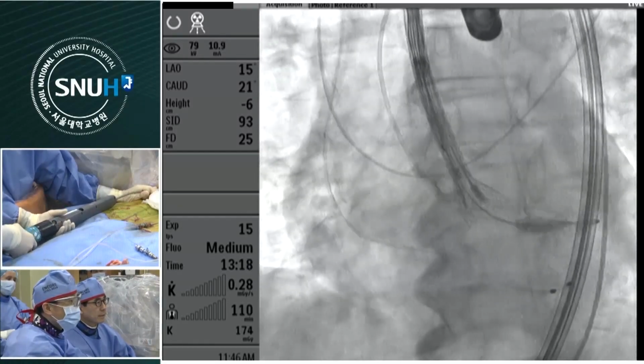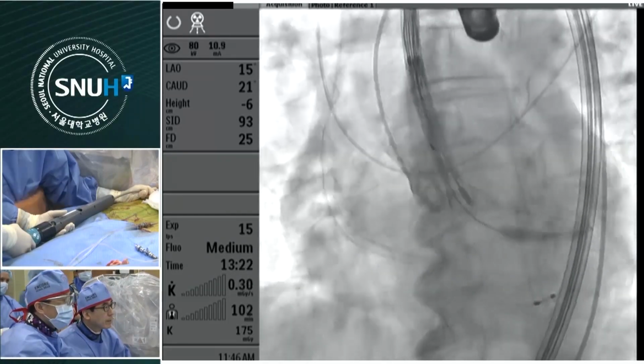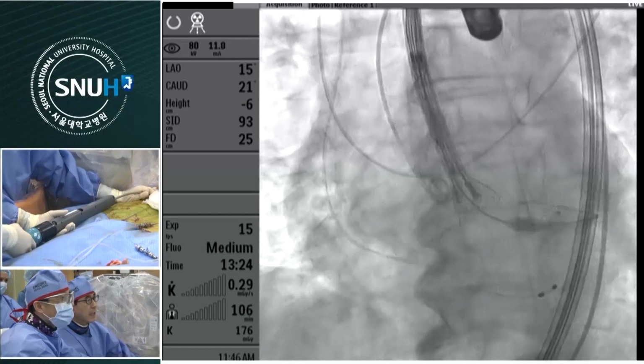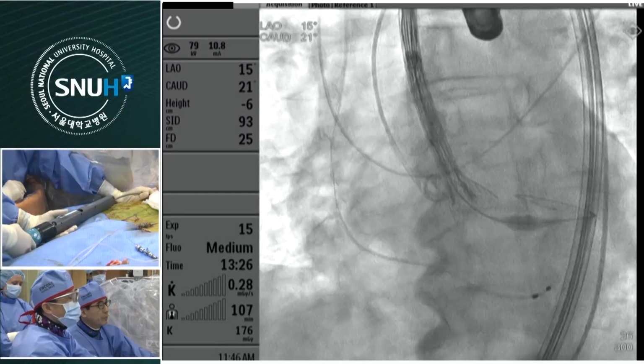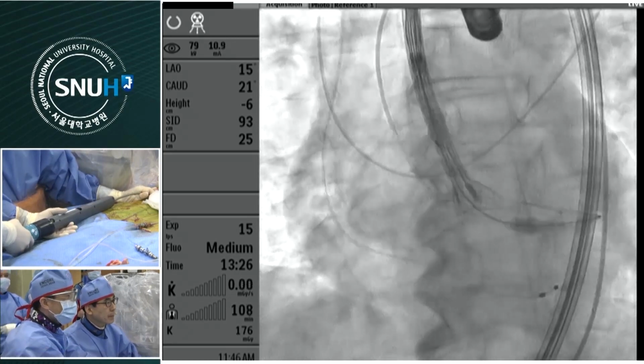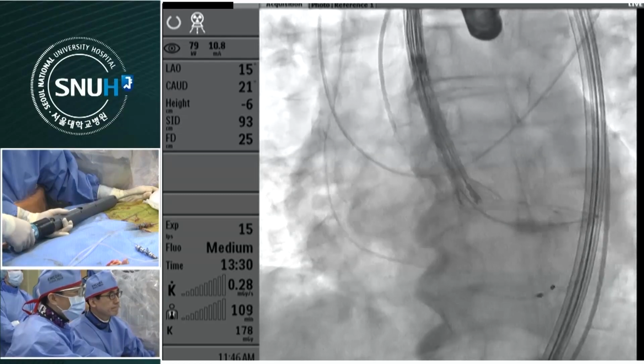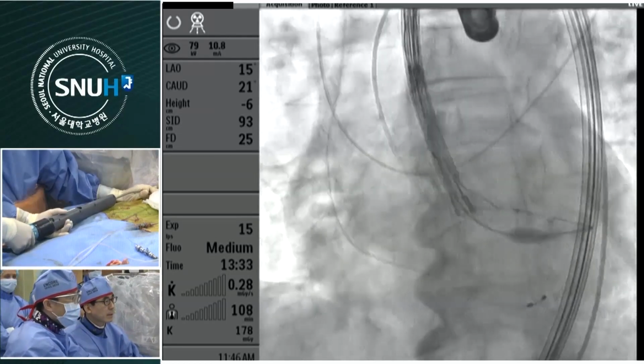Okay, start. Show me the shape. Test. At this status, we once again repeat the deployment process. Start. Deploy. Deploy. Deploy.